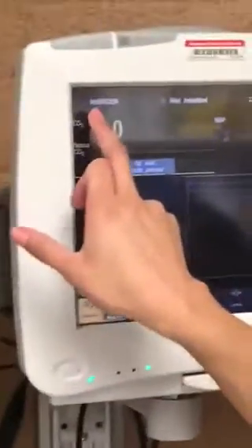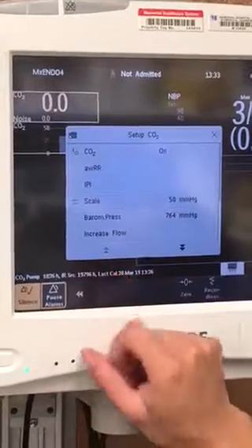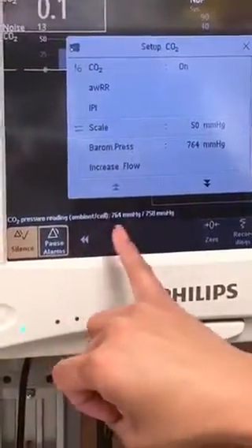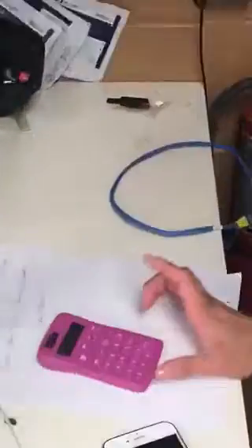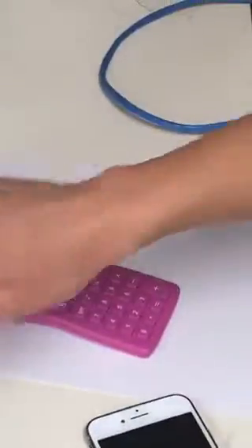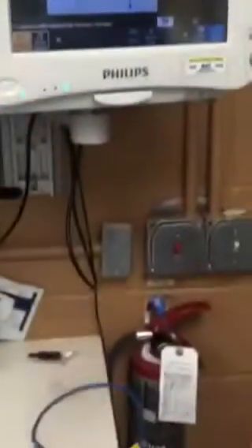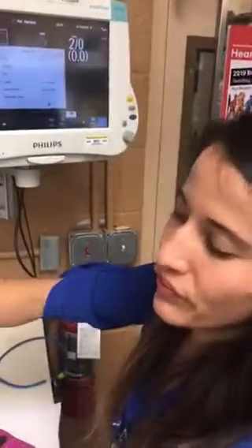If you're in service mode, you go to — you press here, and then you should get this reading of ambient pressure, which is 764 in this case. So you get 764, and you multiply that by 5%, which gives you 38.2, and that should be the reading that we're going to get there. Or it could be plus or minus 2.5.